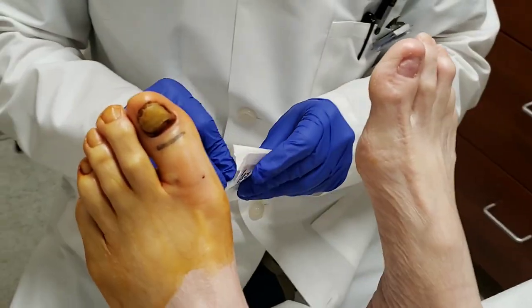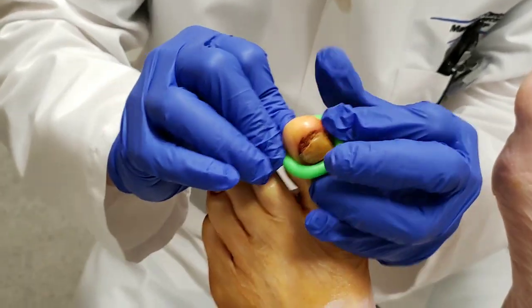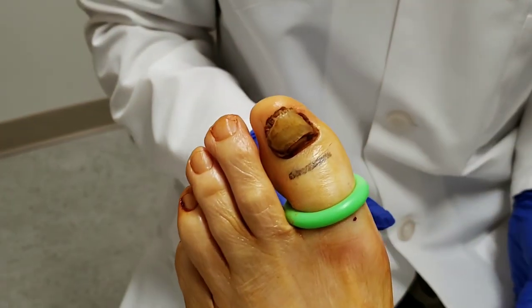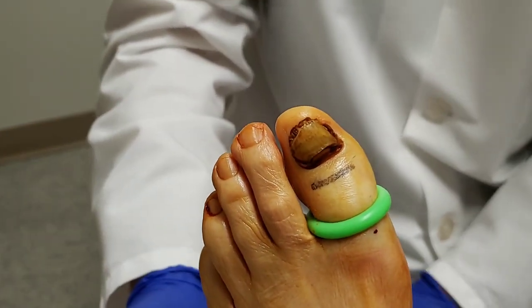So what I do for this — usually there's not that much bleeding, but I like to put on a tourniquet. Now for everyone that is curious, I already did numb up the toe. That's what everyone always asks me: did you already numb the toe? And yes, I did numb the toe.